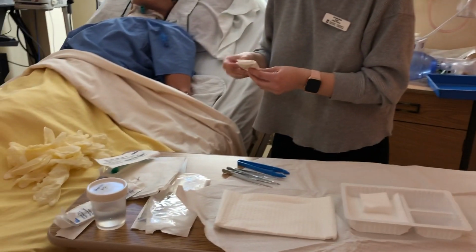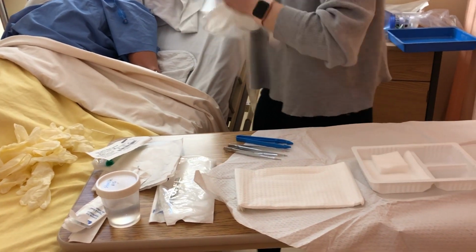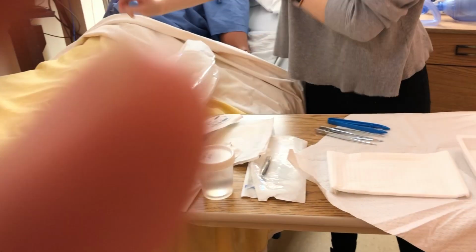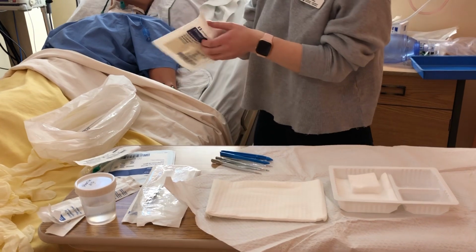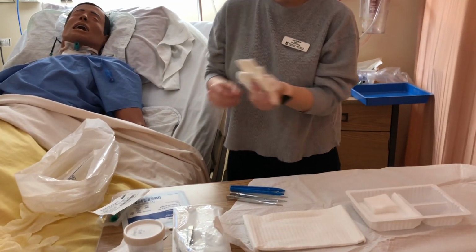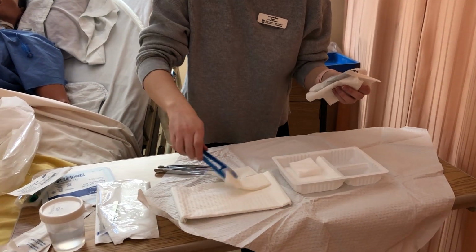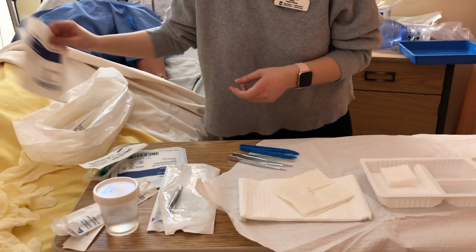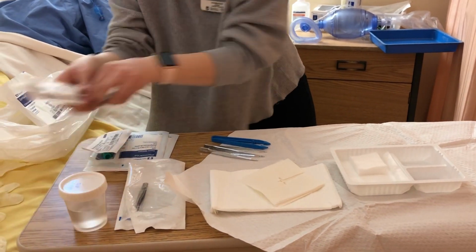My garbage. And I'm going to get an extra dressing. And I'm going to get my swab.